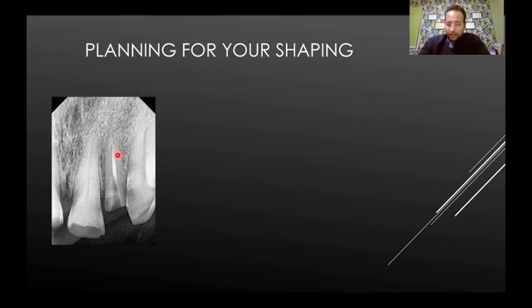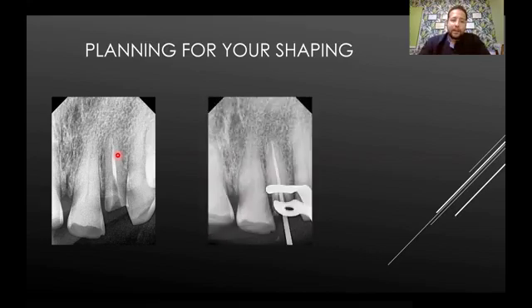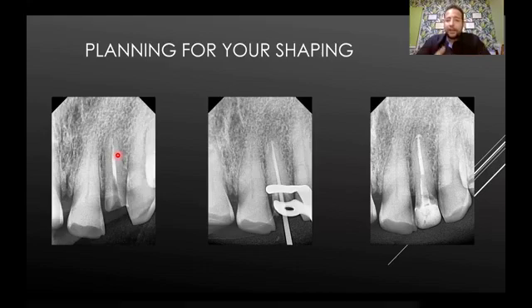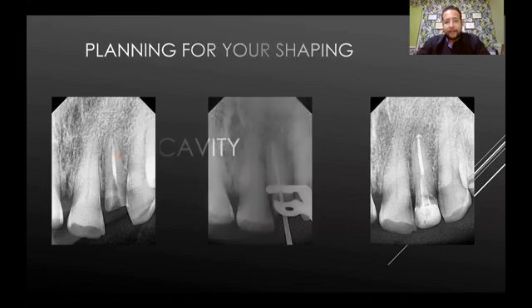So in no time, I was able to remove all the gutta-percha, get my shaping, and remove the post and core in no time. So I chose an austenitic file because it will be more efficient in this straight retreatment case. That's how, when you read the X-ray well, you can also change your file to get the job done in a faster and more efficient way.